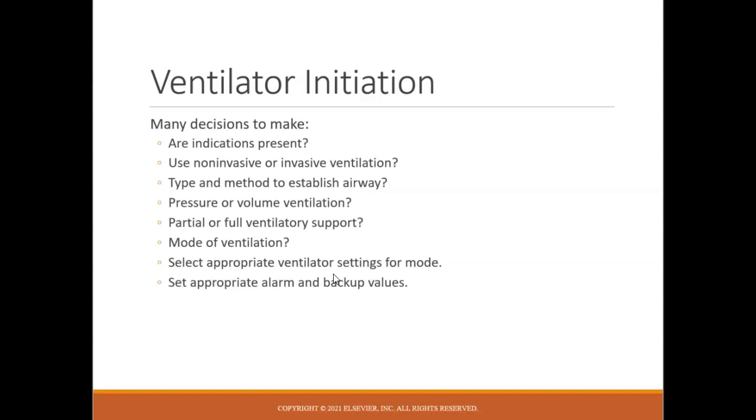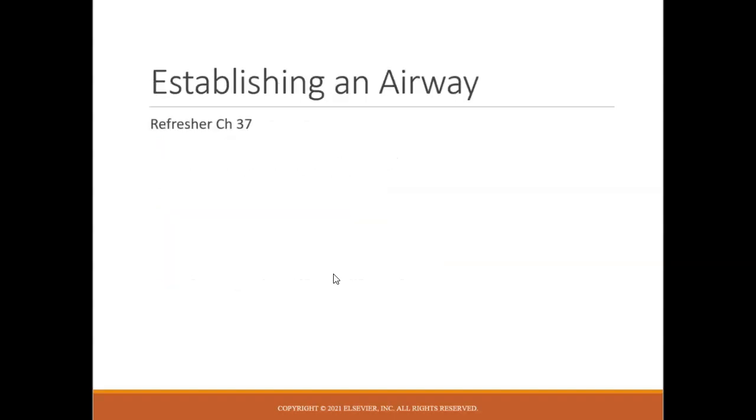Okay, so depending on which mode you're set in, you're going to be having different ventilator settings to set. And then you want to make sure that you have good alarms and backup values. Okay, so your book just talks about establishing an airway. So I think this is an important time to give you guys a refresher, a little bit about some of the key points from chapter 37 in your book.